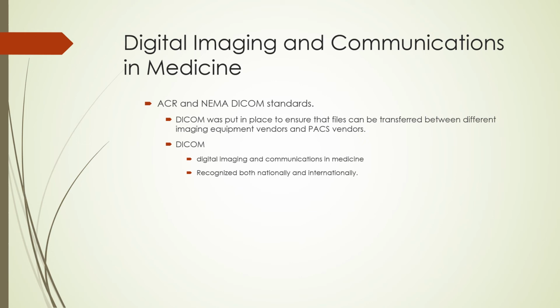DICOM specifies standard formats for images and other information being transferred, services that one device can request from another, and messages between devices. DICOM also provides standards, particularly the Grayscale Standard Display Function (GSDF), for the consistency and presentation of displayed images. We talked about the DICOM GSDF in the second lecture in this series.